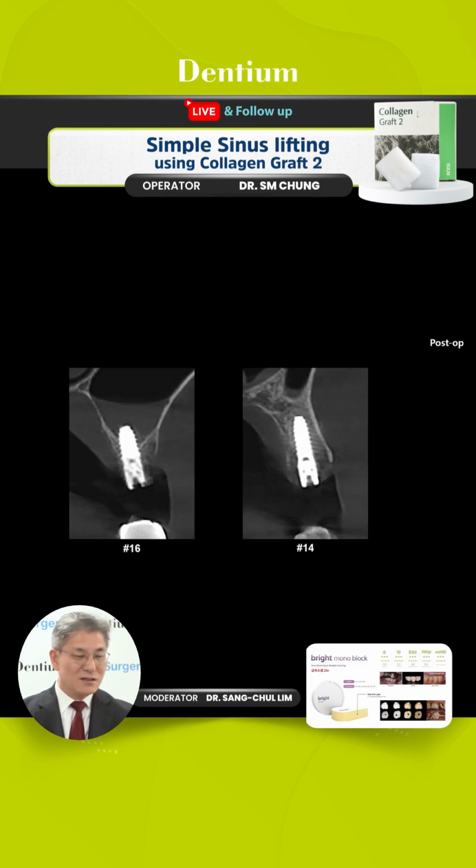In this 16 area, the remaining bone was a small bone volume, the smaller the bone volume. Actually, a smaller bone volume means more time is needed for new bone formation and healing, right? We can see this clearly on the right upper area: the blood vessel, the PSAA artery, was seen clearly on the upper right, inside the sinus wall, right?